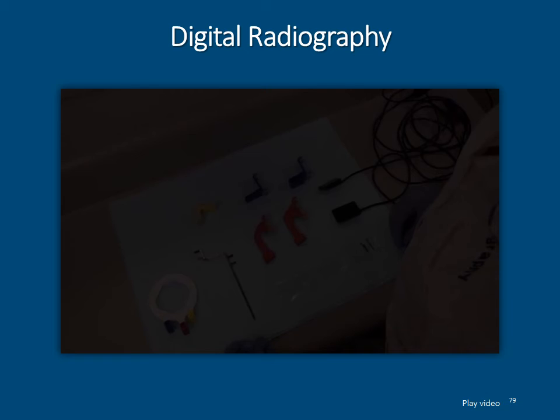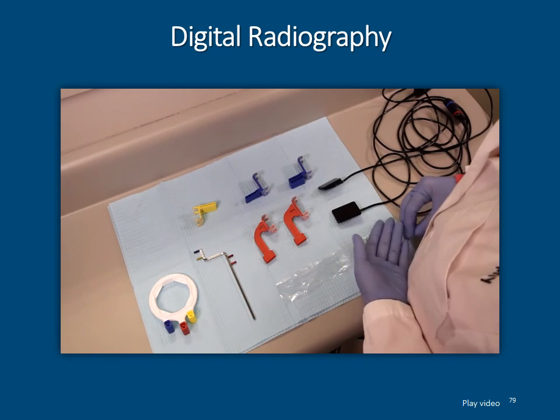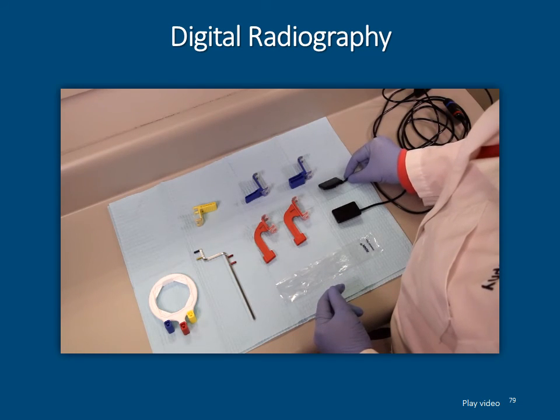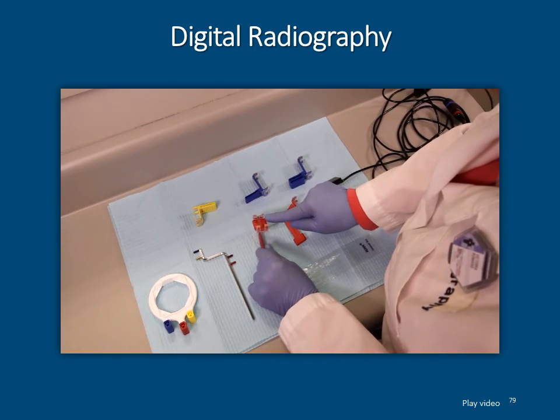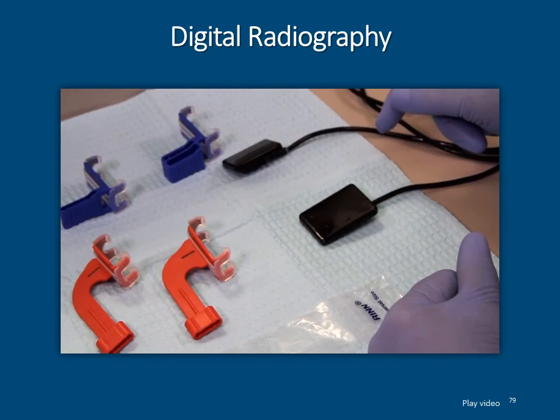This is a lengthy 7-minute video that will go into the use of the XCP RINN when using the digital sensors to expose radiographs. The XCP-DS system is a universal autoclavable holder, and it works well with all the digital sensors in the market. An adjustable clip uses a silicone band to keep tension on your sensor as you're using it and working with it.